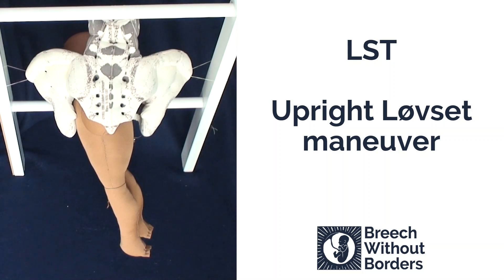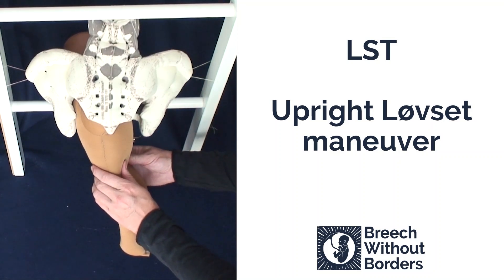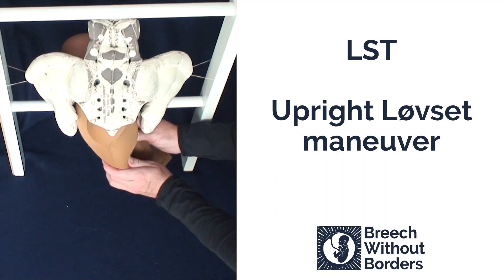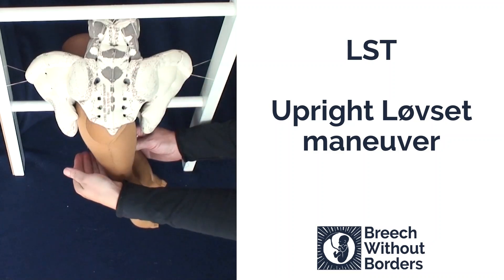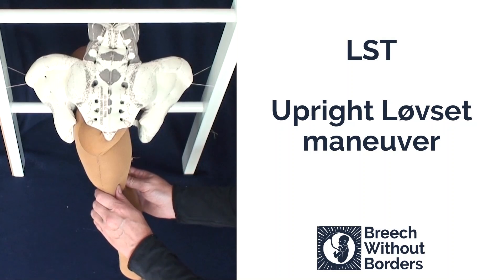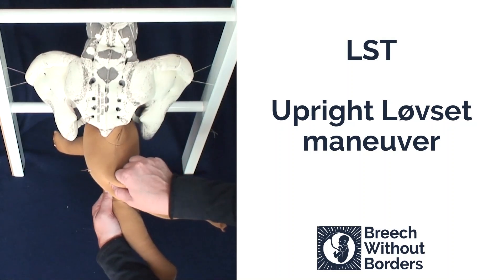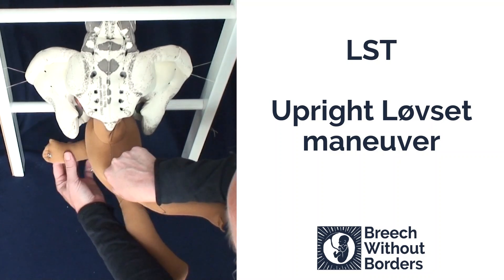This is Løvset in an upright position with the baby in left sacrum transverse. First, you grasp the baby's pelvic girdle. Then you flex the baby laterally, bringing the posterior shoulder quite low down the sacrum, following the direction of the sacral curve as you flex laterally. Then, exerting traction straight towards yourself, rotate 180 degrees, going through sacrum anterior to the other side. This releases the first arm under the pubic arch.